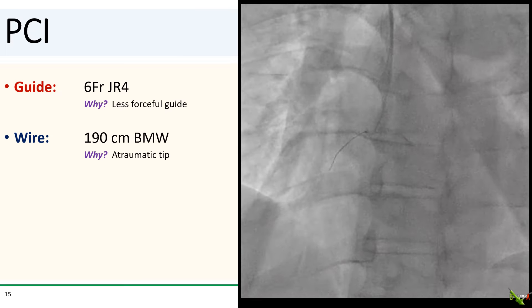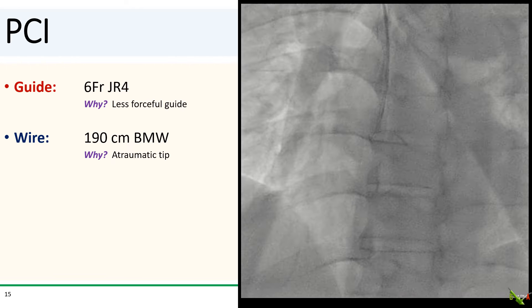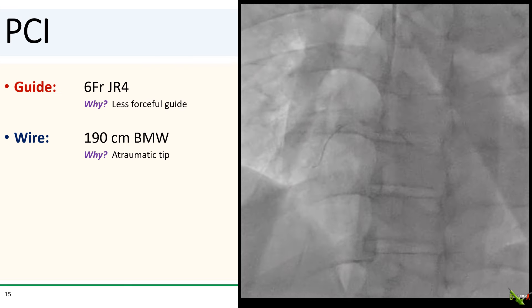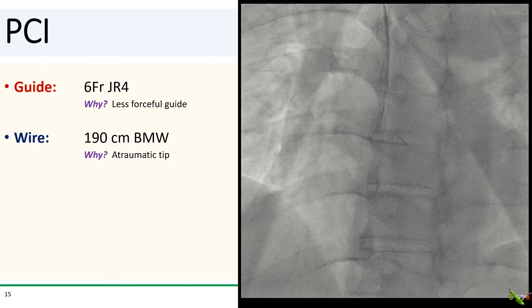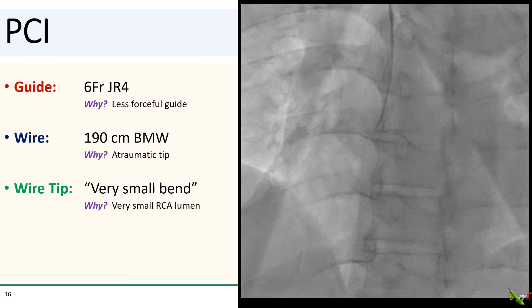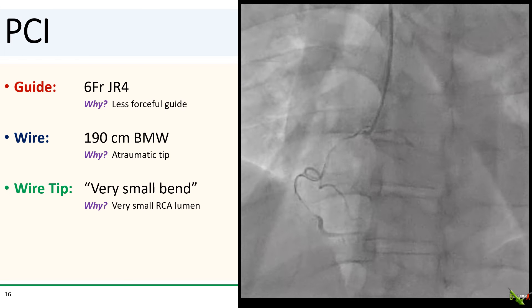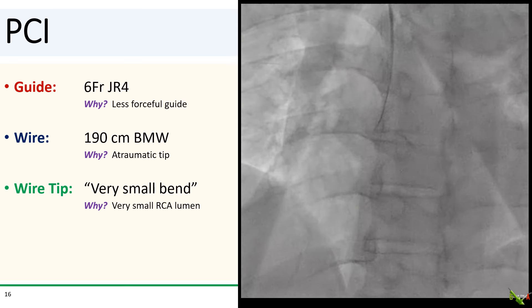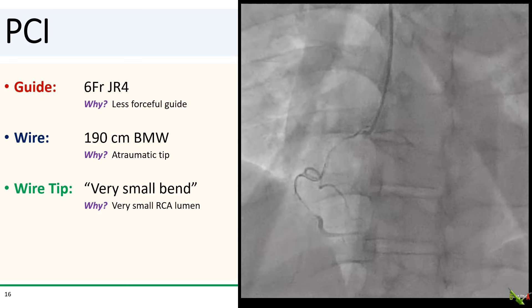I chose a BMW wire. The BMW is my standard STEMI wire, but it's also well suited here because the tip is fairly atraumatic. We have type 2 SCAD here — there is intramural hematoma but not yet an intimal tear. We don't want our wire to poke a hole into the bulging intima and convert this type 2 SCAD to a type 1 SCAD with a true dissection and a false lumen. For my wire tip, I used a very small bend — not quite a CTO tip, but maybe just a little bit bigger. The lumen of the RCA in the SCAD segment is very small, and a big tip will make it harder to get through and increase the likelihood of engaging side branches or scratching the intima.